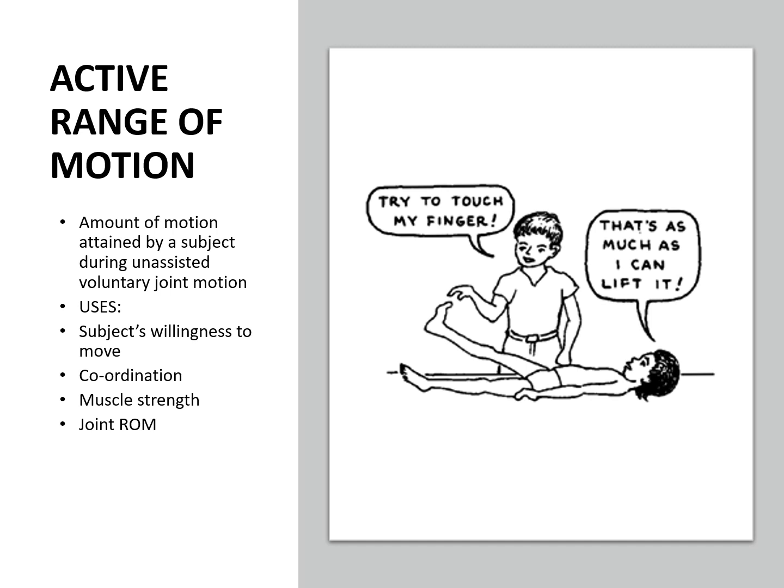And lastly, when you are measuring that range of motion with a goniometer, it will tell us whether that much range of motion is available at the joint or not. If there is reduced range of motion, we can understand that there are some issues with the joint itself. That is why active range of motion is very, very important when you are dealing with your patient.